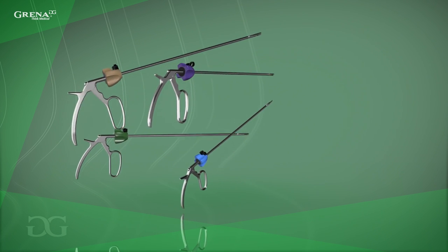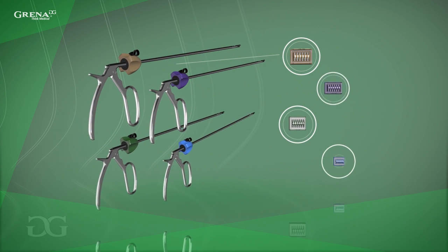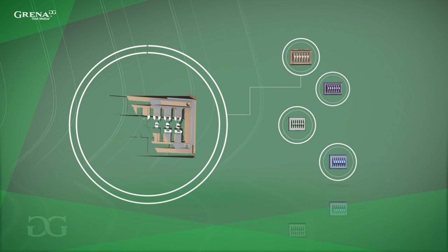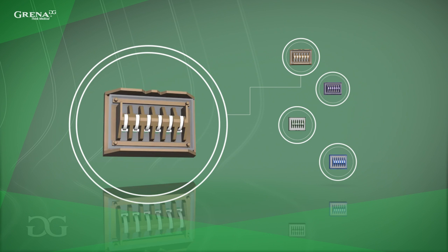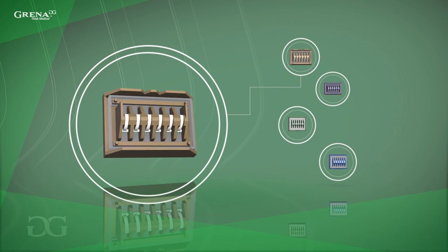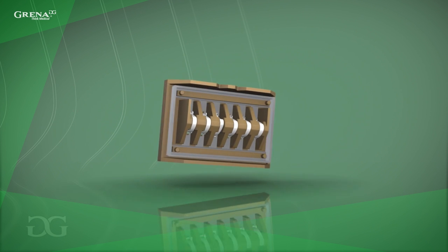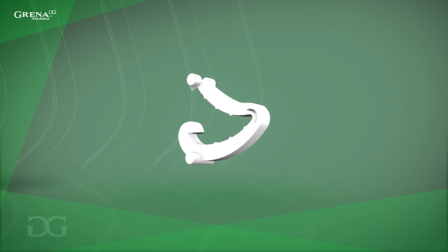Grena's color-coded clip applier matches the exact hue of a cartridge containing corresponding sizes of polymer clips. Each cartridge contains four or six polymer clips. This makes it possible to accurately fix the clip onto tissue with unlimited hold-on time. When necessary, a clip can be safely removed with Grena's clip remover.